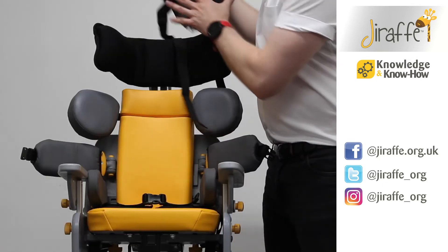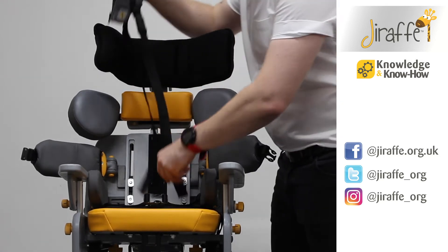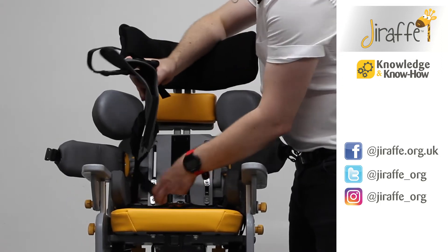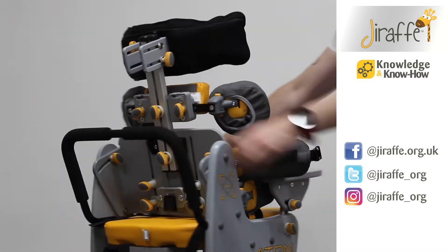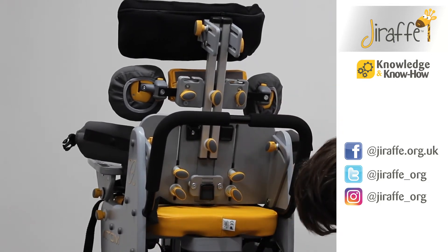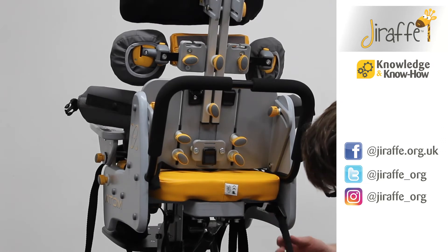With the bottom straps, if I just remove the back pad, it's a bit easier to see. So we're going to feed the back straps through the back of the chair, and as you can see, we've got a gap between the back of the chair and the side panel and another cam lock here. We're just going to feed those through the cam locks.